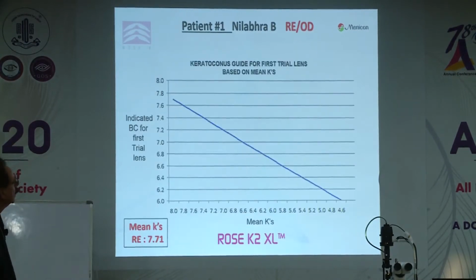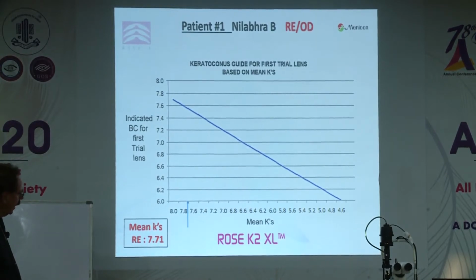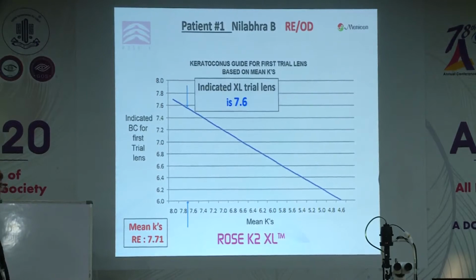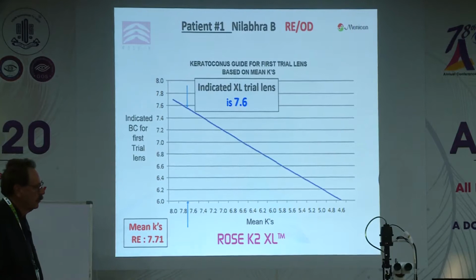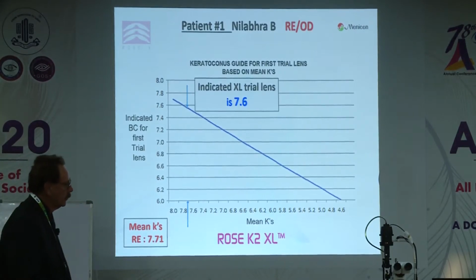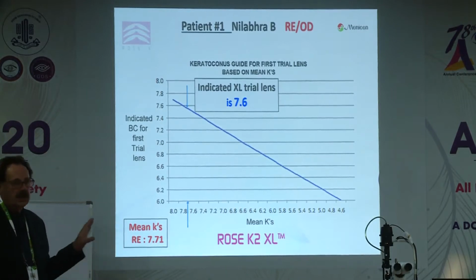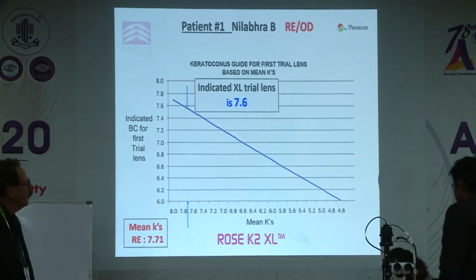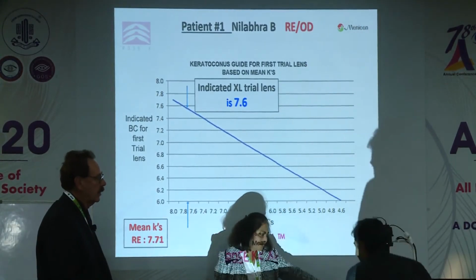So, the keratoconus guide for XL: the mean K of 7.7 indicates your first trial lens at 7.6. So can we go ahead and put the 7.6 lens in? We've already just now inserted that 7.6 with the fluorescein in the eye, and you can come in here. So the indicated lens is 7.6. The first thing, if we can go live now with the slit lamp, please.